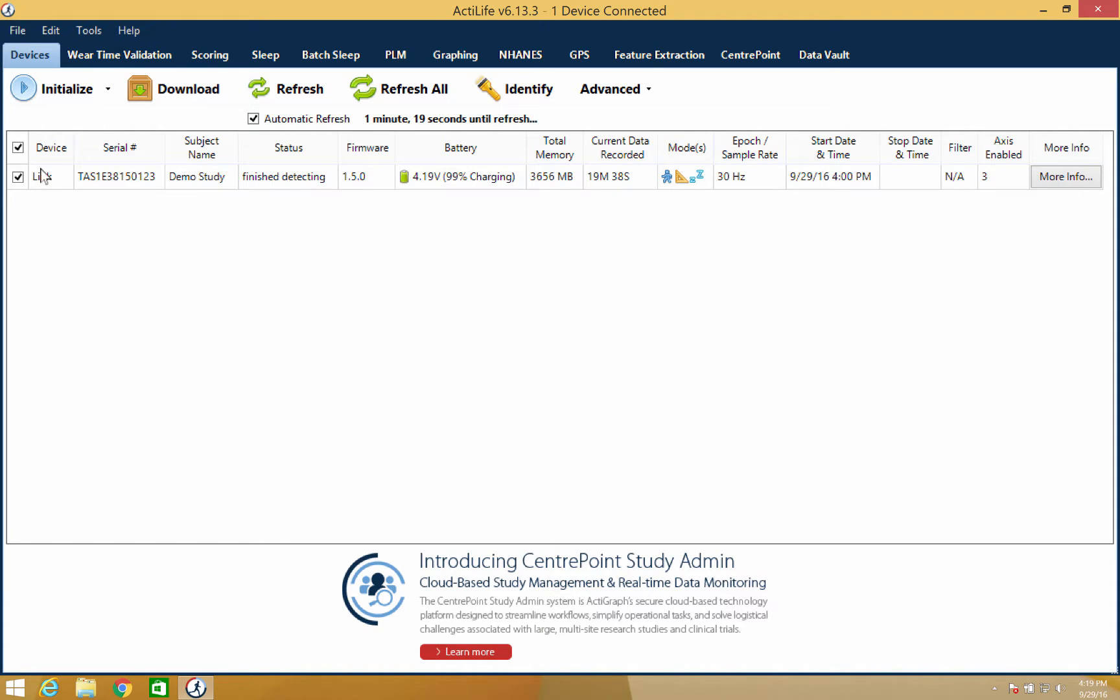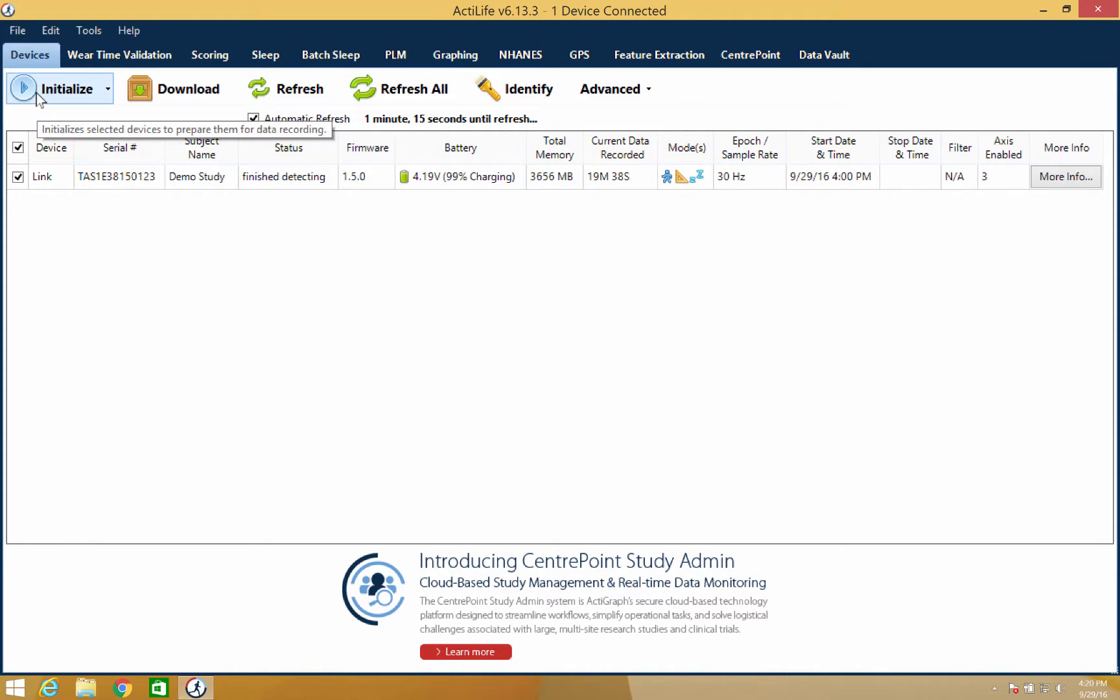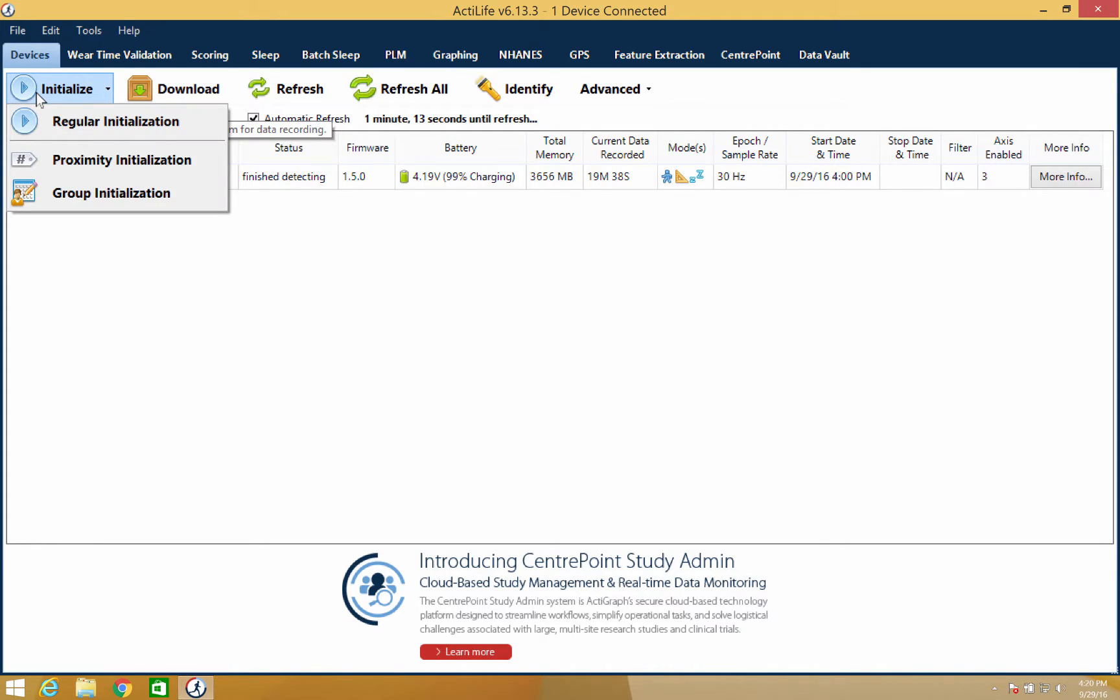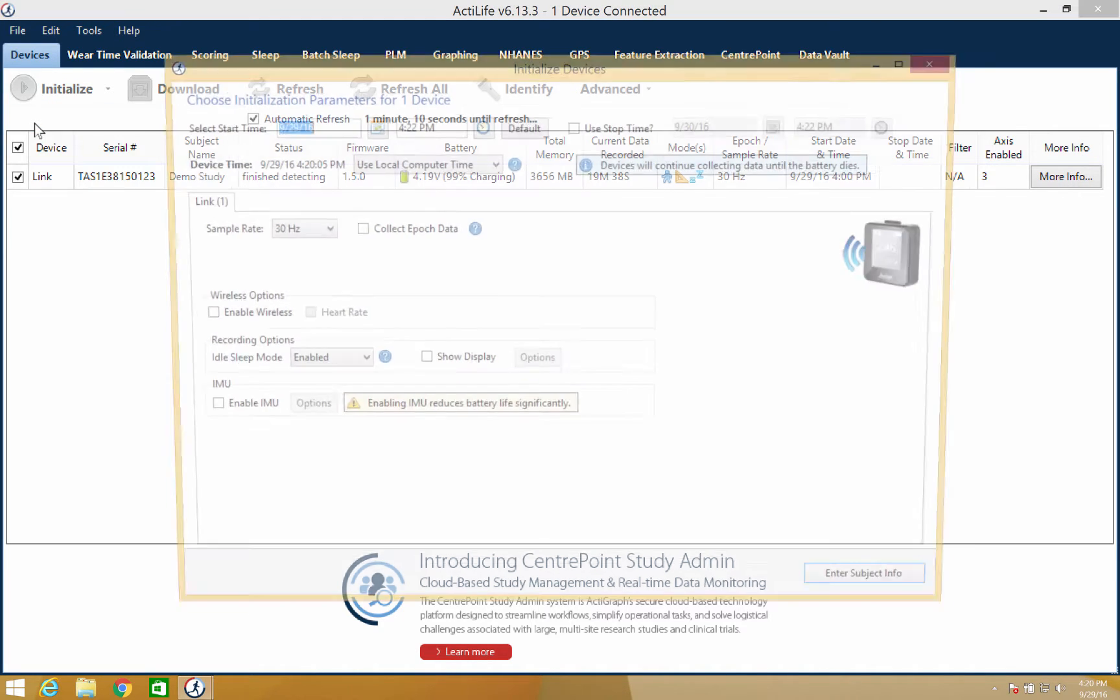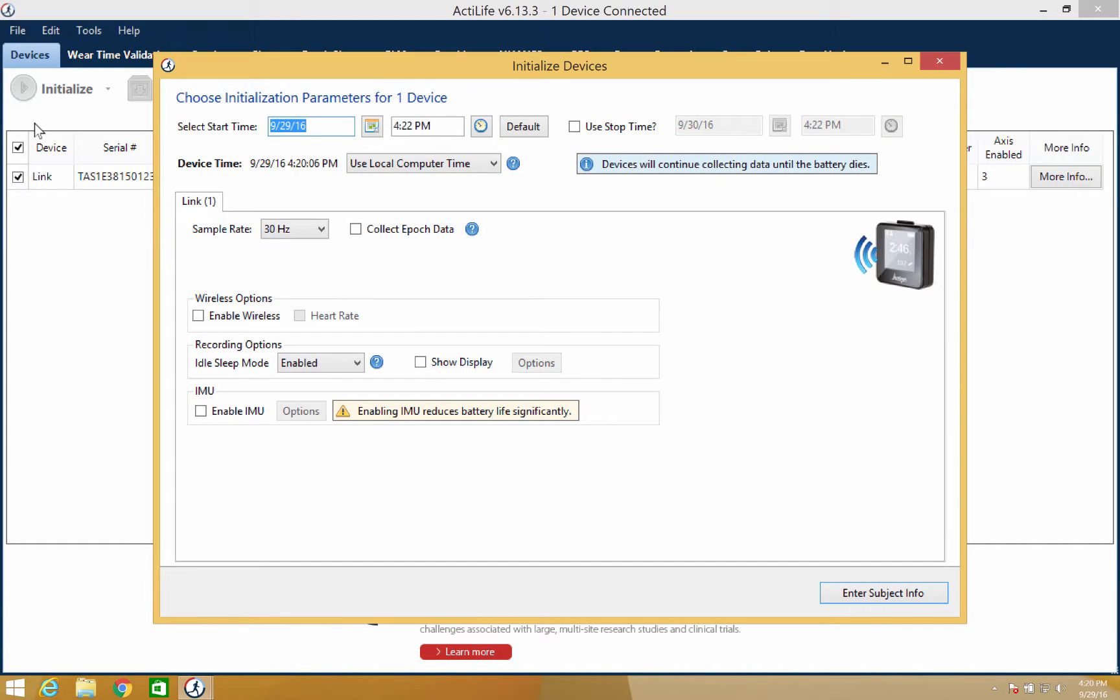Making sure the checkbox next to the device is selected, click the initialization button and then select regular initialization. This will open the initialization floating window and we can now set our data collection parameters.